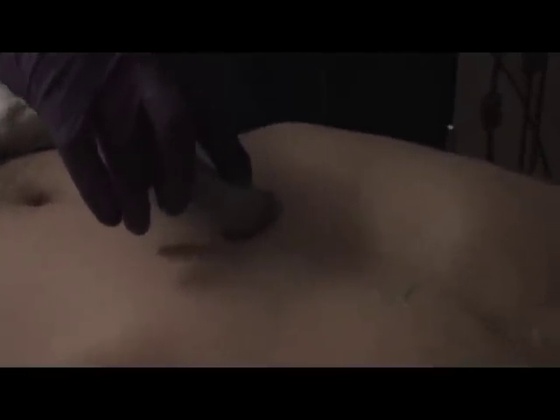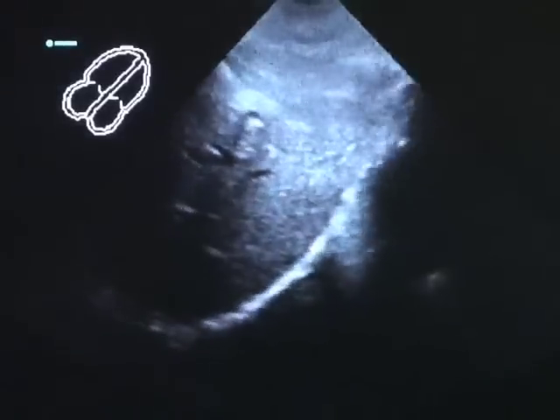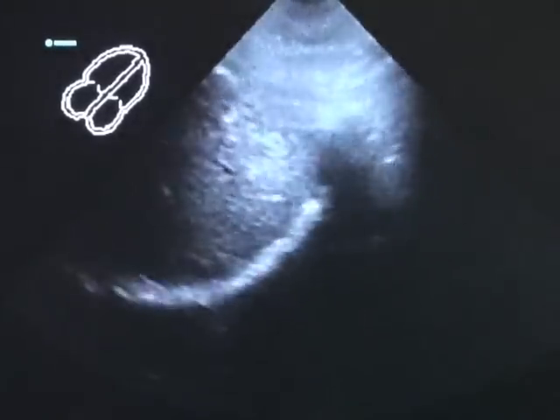Another common view is a subxiphoid. You can move the probe with the probe pointing over toward the patient's right side. We can put the probe in the subcostal margin. As Dr. Kuby is demonstrating, you hold the probe on the cephalad surface, putting the finger down to put downward pressure, trying to get in that subcostal margin, aiming up toward that right shoulder, getting the liver in the near field, following the IVC, and flattening the probe out to actually visualize the subxiphoid or subcostal view of the heart. On this view, you'll see 4 chambers.